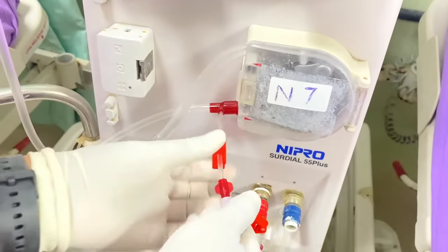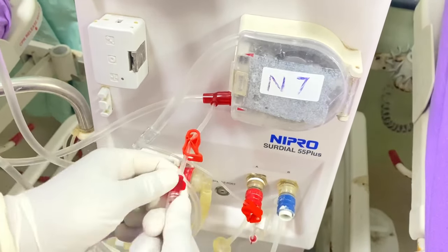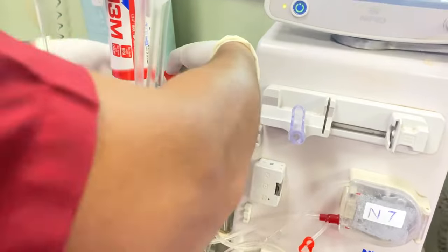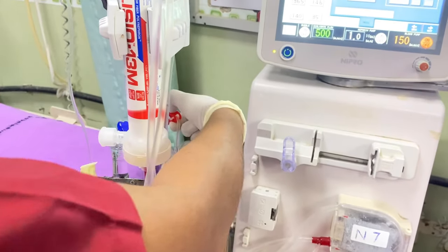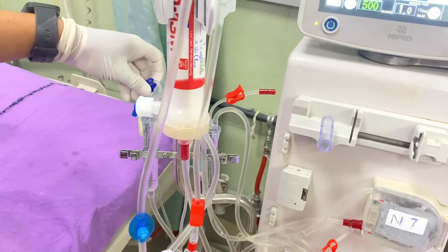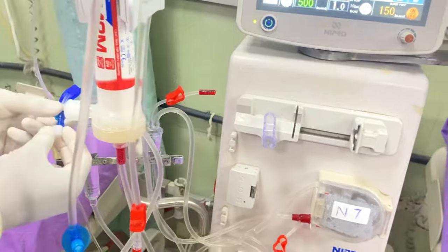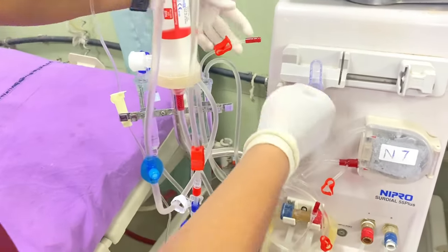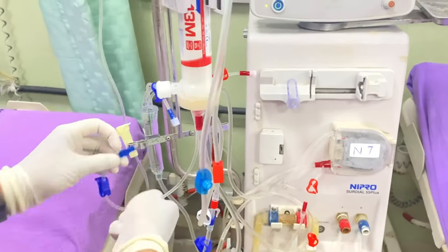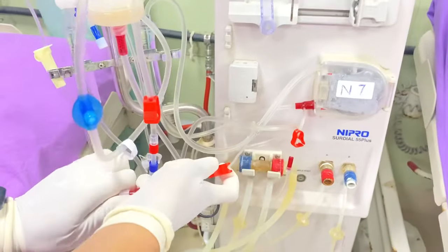Connect the IV set to the IV line — this is called the IV line. Always remove air from all lines. This is the arterial chamber line, and we also have two lines on the venous chamber — remove air from these also, because as already told, it is sterilized by chemical. The largest line is the venous line. You can see this is the heparin line.